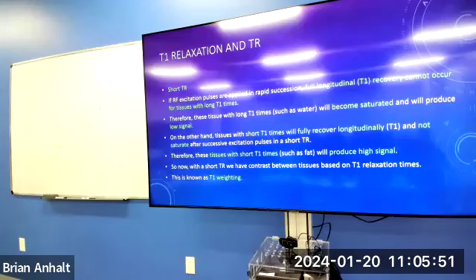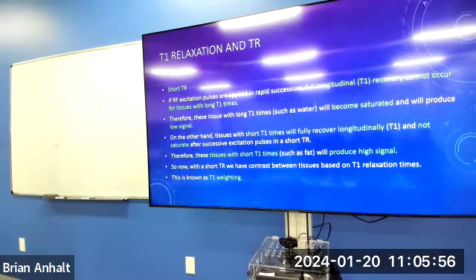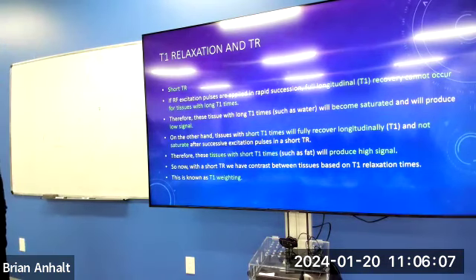Now you'll see the word saturated with energy, right? Remember, longitudinal recovery is a loss of energy. Remember, T1 recovery is energy back to the lattice, right? So those protons are popping back up here, losing their energy, longitudinal recovery. If we saturate them with energy and they keep energy, that longitudinal component will not regrow. Therefore, there will not be anything to flip, or not very much to flip, back into the transverse plane, and it is not going to produce signal when we listen back to the echo. Or when we collect the echo. We're not listening. I always say that, but it's just an analogy, right? When we collect the echo.